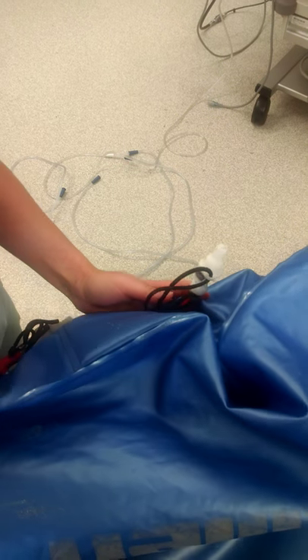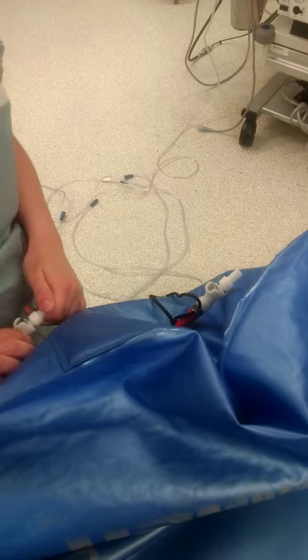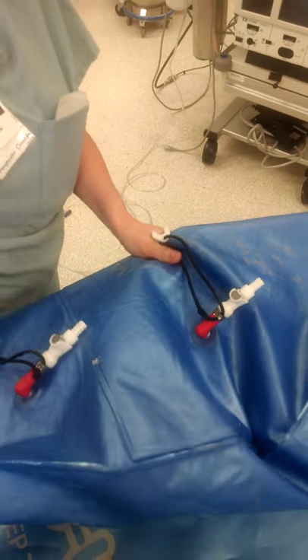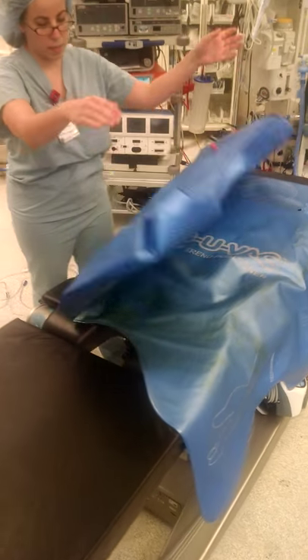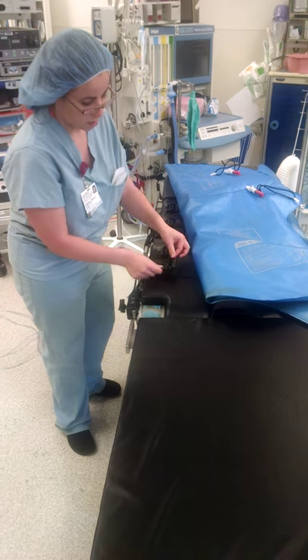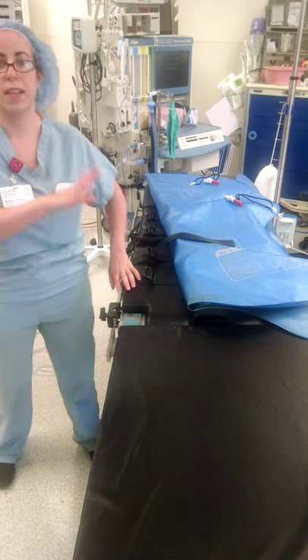And that is how you set up the bean bag for a Steep Trendelenburg case. Once you are done, you can take those little clips out and push back, and that will release the suction so that you can get your patient off the table. Then to take the bean bag off the bed once your cases are done, just push up on this plastic clip and feed back the black straps. You can do that eight times, then take it off the bed and you're done.